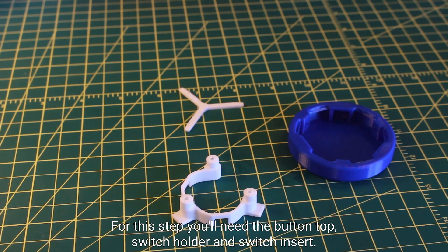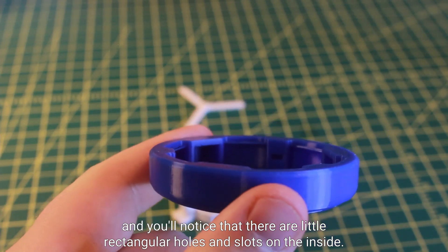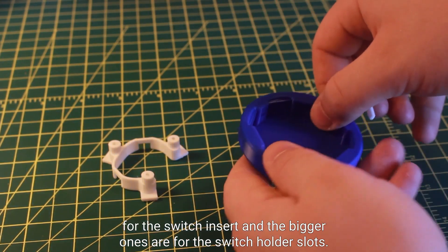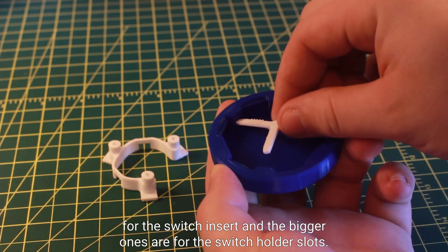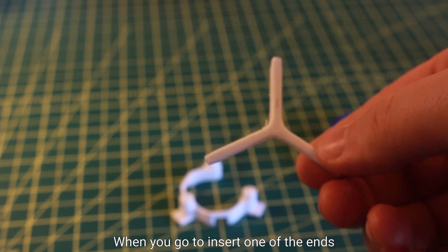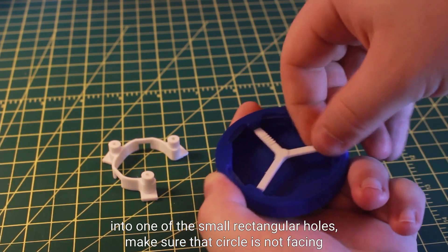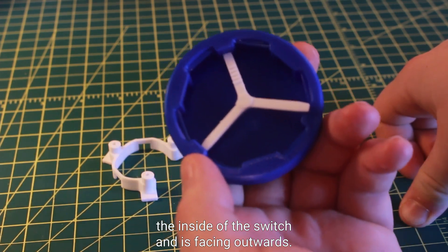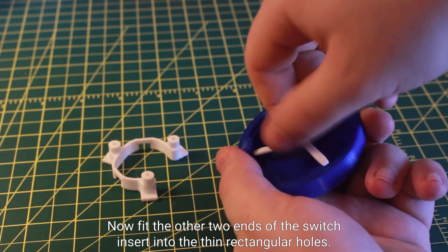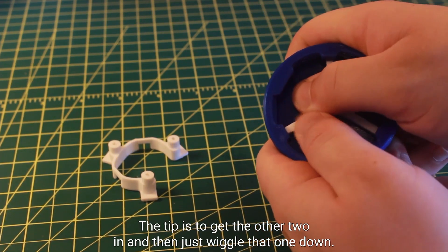For this step you'll need the button top, switch holder, and switch insert. Look on the inside of the switch button and you'll notice that there are little rectangular holes and slots on the inside. The really small thin ones are for the switch insert and the bigger ones are for the switch holder slots. Take a look at the switch insert and notice one side has a raised circle. When you go to insert one of the ends into one of the small rectangular holes, make sure that circle is not facing the inside of the switch and is facing outwards. Now fit the other two ends of the switch insert into the thin rectangular holes. The third one can be a little bit tricky. A tip is to get the other two in and then just wiggle that one down.